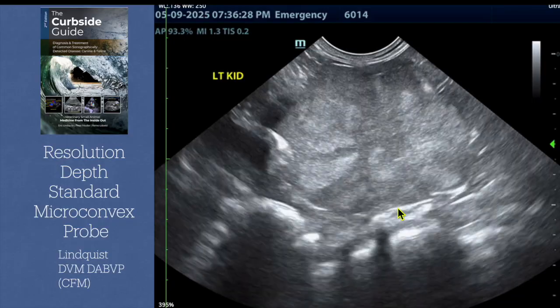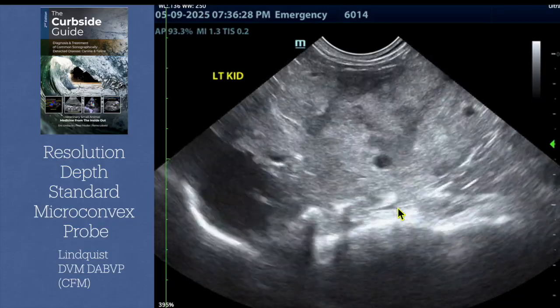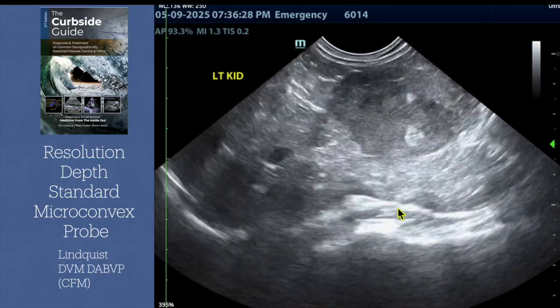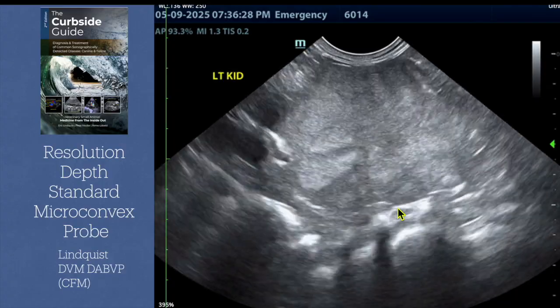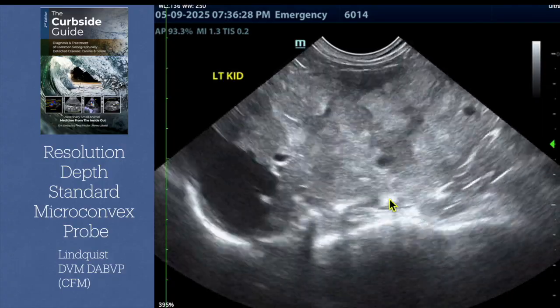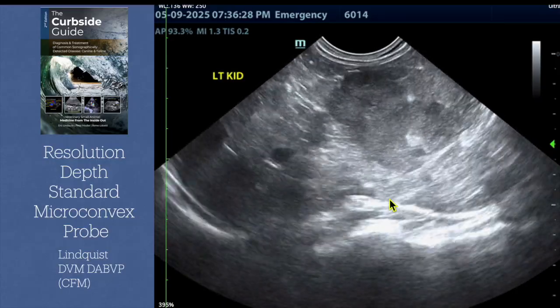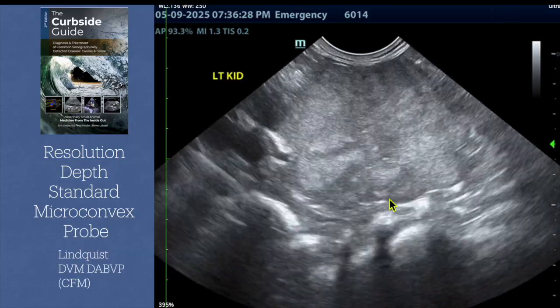So I take this animal to the next machine and I test it out just like we did, because we already eliminated the first one because we know where that's going to be problematic for us. So now we have two machines in play, and maybe this one, then I would test power Doppler, for example, right? How's your power Doppler on this lesion compared to the other one? How's the color Doppler on this lesion compared to the other one? Because color Doppler and then power Doppler are very, very sensitive modalities. So your physics have to be optimized, right?